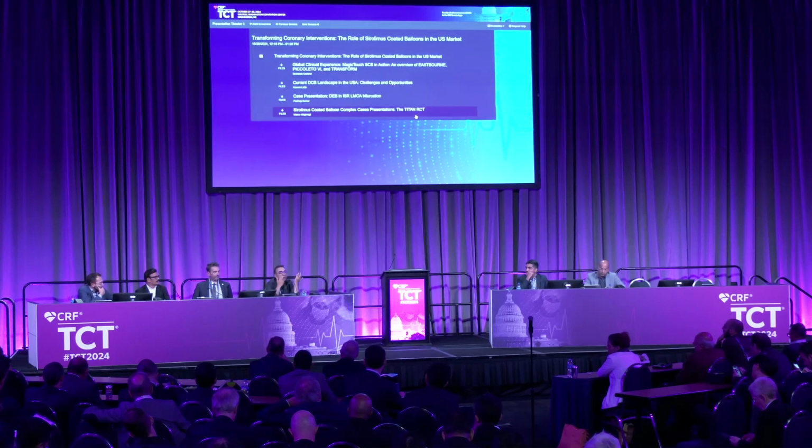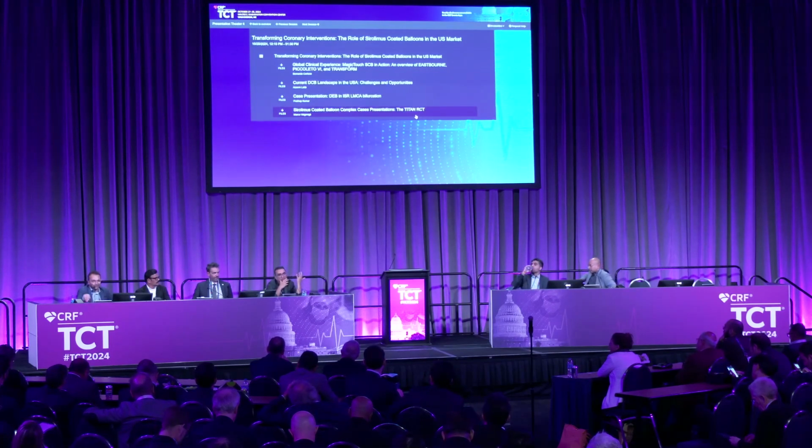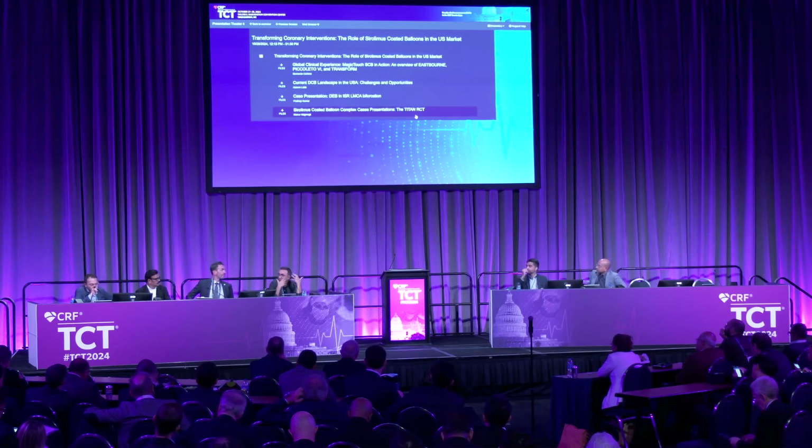So I guess in some way it's to try and delineate, we always talk about uncaging vessels and not caging vessels. It allows better vasomotion. It allows more positive remodeling. So in some way, you're looking for some sort of surrogate of why a DCB could potentially be better than a stent. Is that correct?